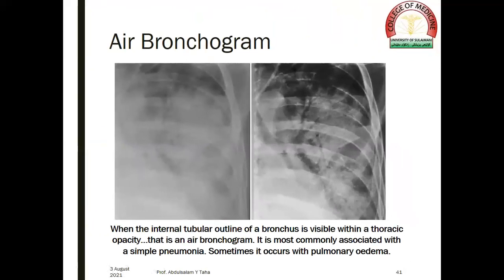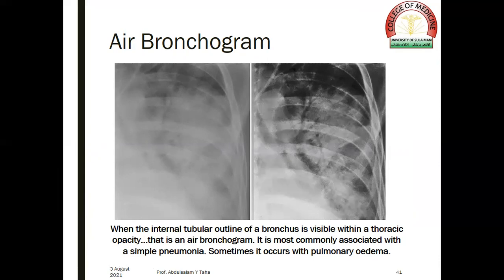The air bronchogram is an important radiographic sign. Normally both the bronchi and the adjacent lung parenchyma or alveoli contain air, so both are radiolucent. But when the lung parenchyma is consolidated and the alveolar air is replaced by fluid and/or cells, the lung parenchyma becomes radio-opaque and this will outline the air-filled bronchi. When the internal tubular outline of a bronchus is visible within a thoracic opacity, that is called an air bronchogram. It is most commonly associated with simple pneumonia, and sometimes occurs with pulmonary edema.